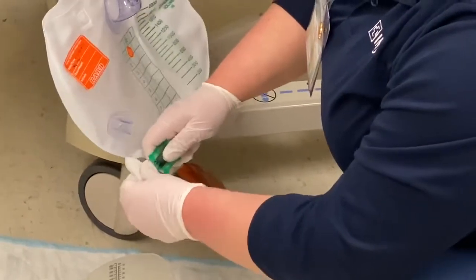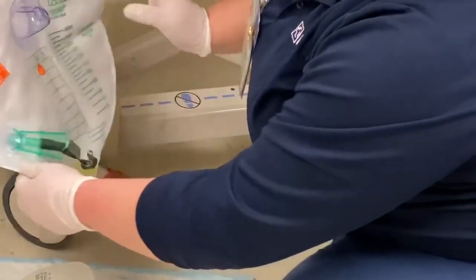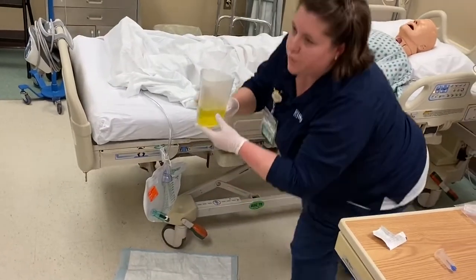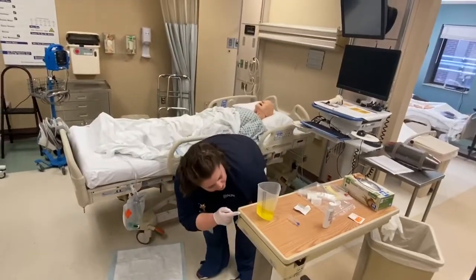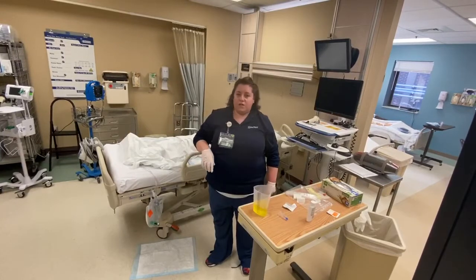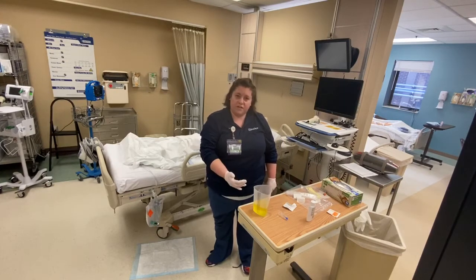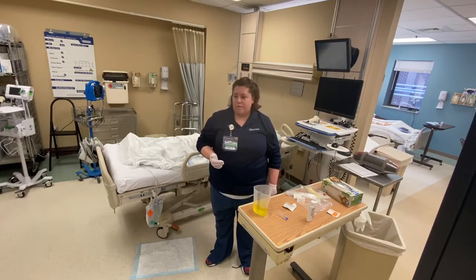All right, so I've cleaned for 15 seconds, and I'm very carefully gonna clip this back into place here, and my bag is empty. At this point, I'm gonna take my urine canister, I'm going to put it on a flat surface. I'm going to get down at the level of the liquid to measure it. I'm also noticing the color, the clarity, if there's any smell, and my fourth characteristic is amount. I'm going to document those in Epic and also share them with my nurse.